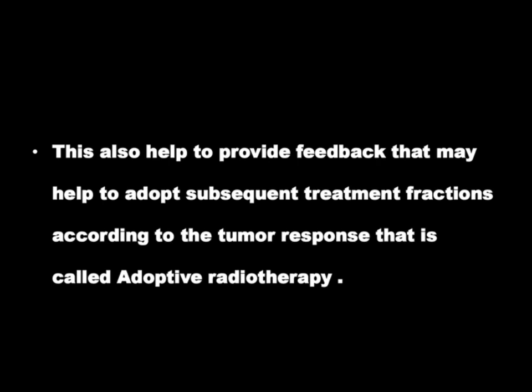The sophisticated imaging techniques are CT scan, MRI, and PET scan. They all obtain 3D images of the target volume, as well as biological and functional information of the target volume with the help of PET CT scan. Thus it enables precise and accurate treatment.